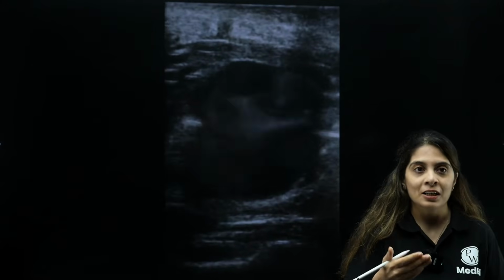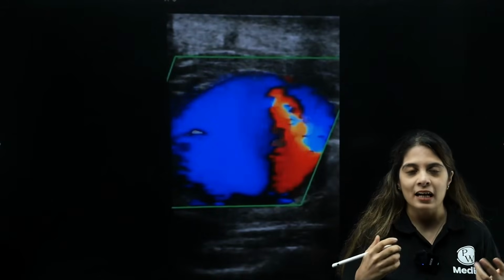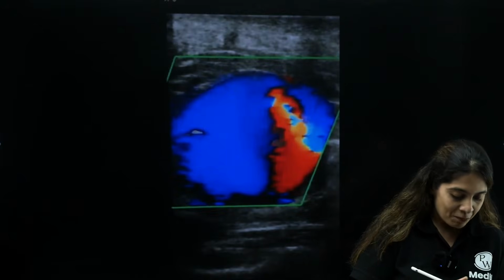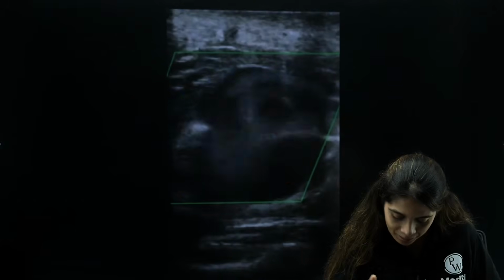So this is one of the videos which I was very fascinated by. I think in my residency, I was an R1, and I had captured this video, and I'm so glad that I'm able to share this video today. So this is a very classical, if someone has written.